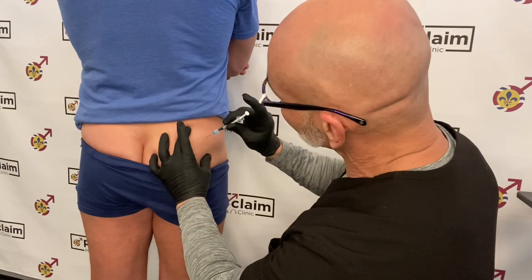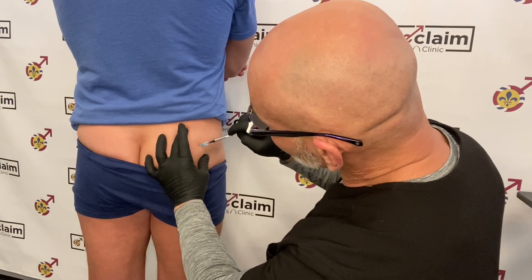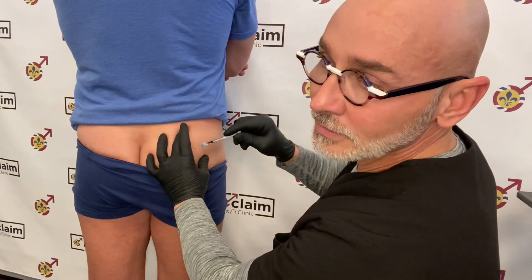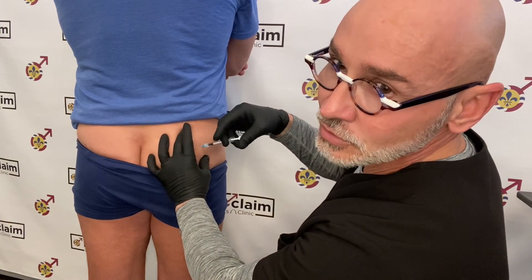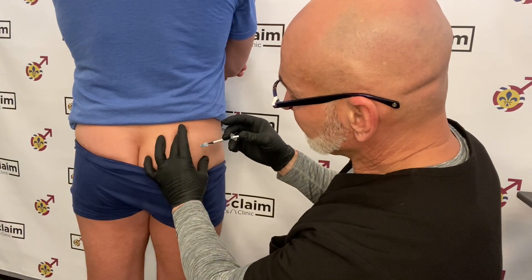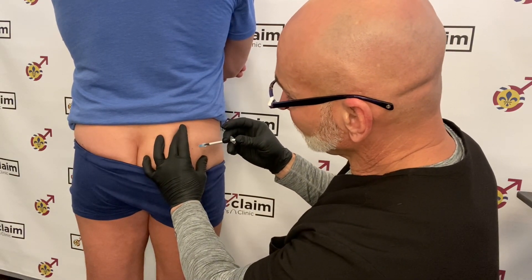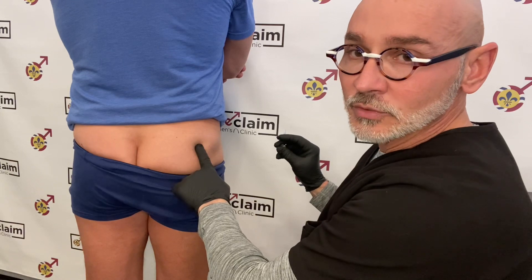Are you ready? One, two, three. Once you're in, you'll want to pull back on the plunger to make sure you don't have any blood. If you do, you'll want to start over because you do not want to inject into a vessel or an artery. Then inject the solution slowly. Once the solution is in, pull back on the needle and put your finger over to avoid bleeding or bruising.